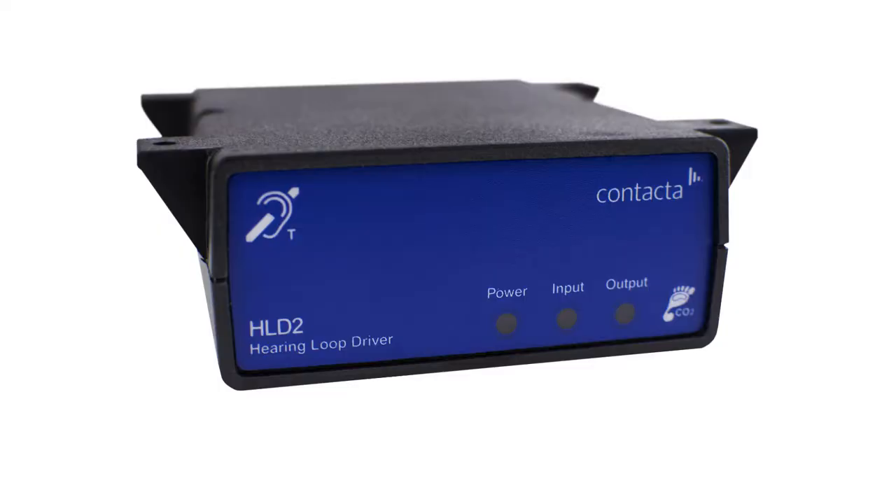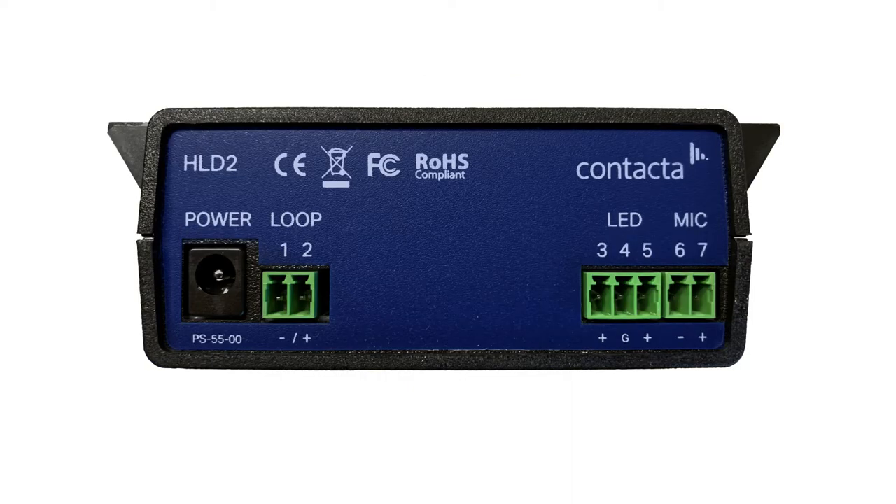On the front of the HLD2 is the power LED, input LED and output LED lights. On the rear of the unit are the power connection, loop input, LED input and microphone input.